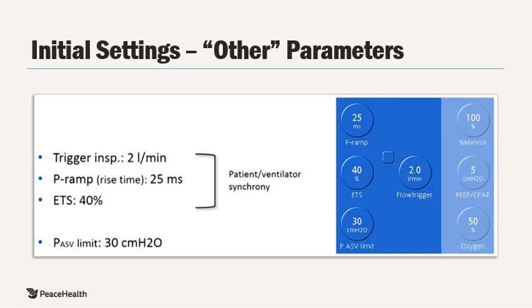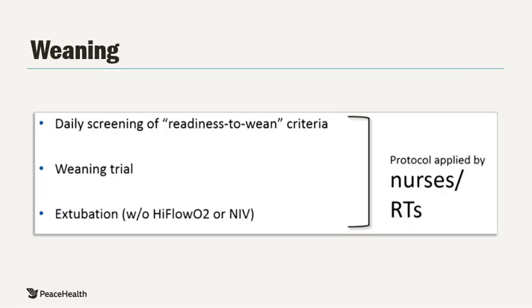Once a provider starts de-escalation cares, we can begin to utilize the weaning tools of ASV when weaning.